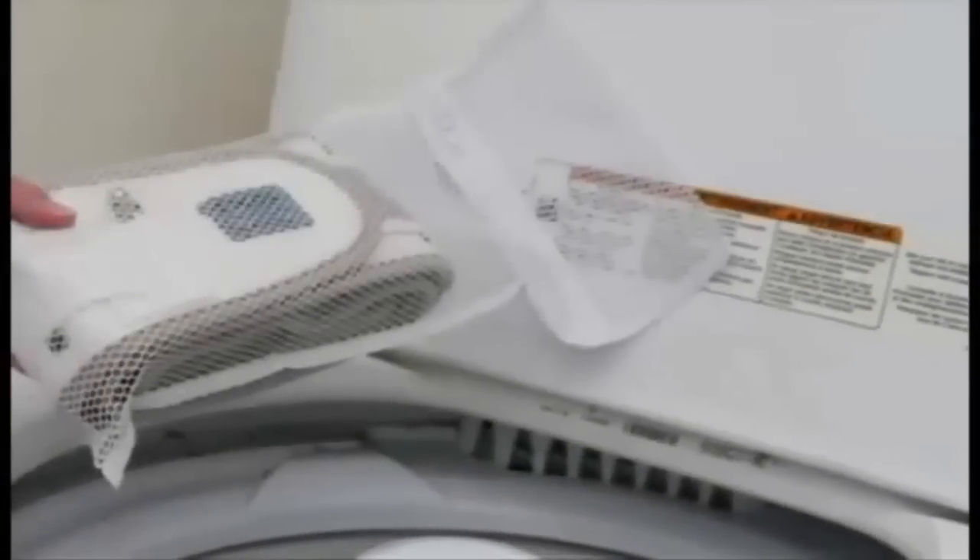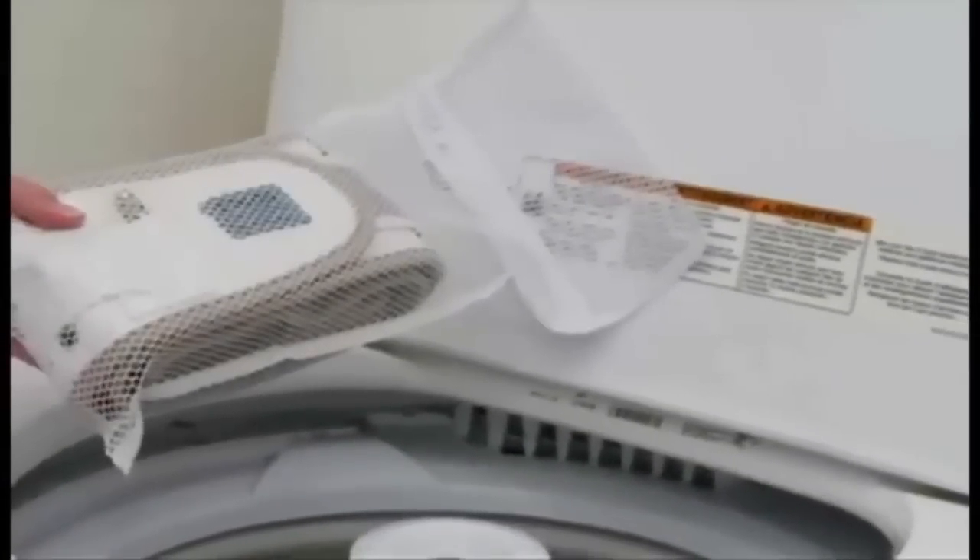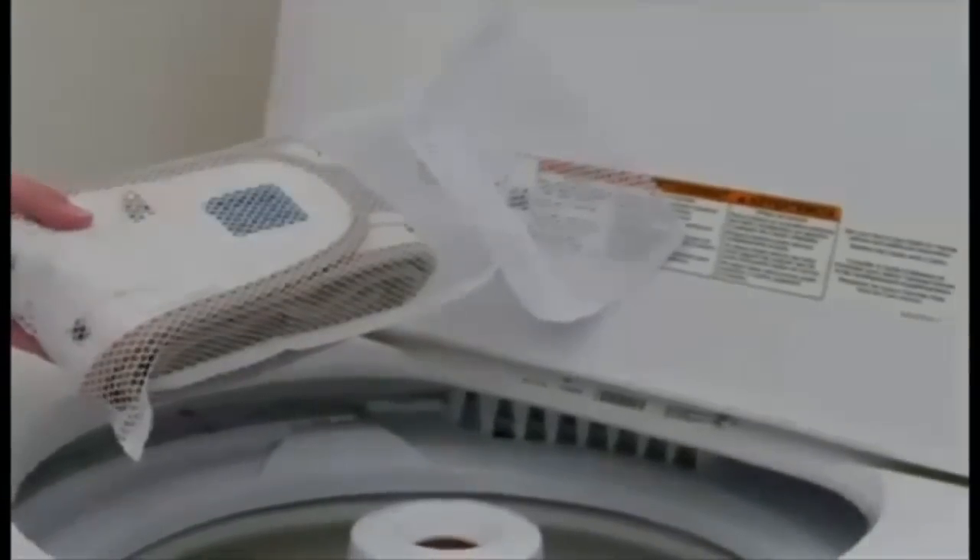Remember the belt is completely washable. Please refer to the user manual for complete washing instructions. We hope these simple instructions get you on the road to enjoying life with less pain and more comfort.